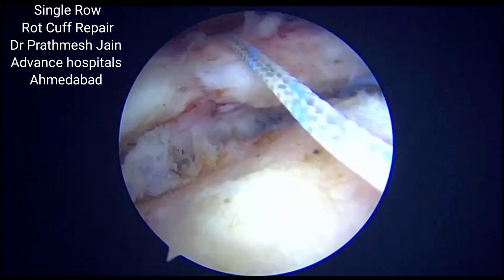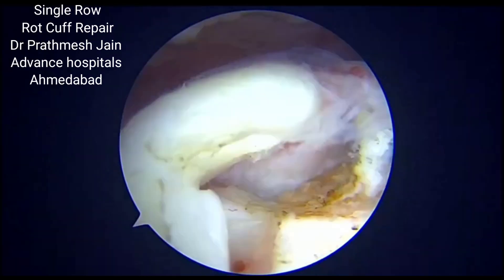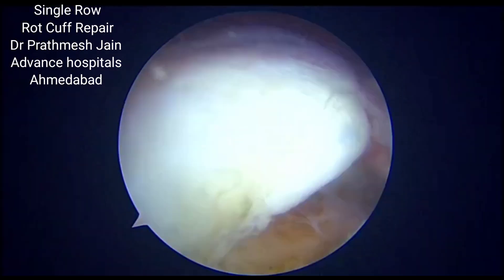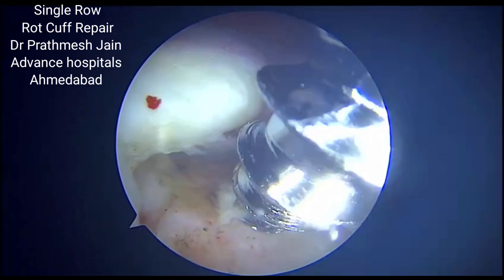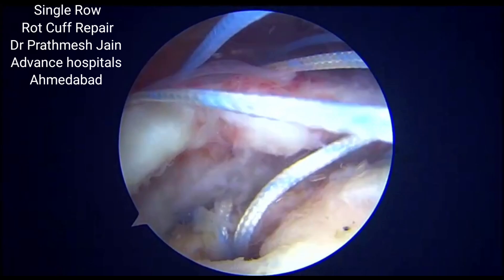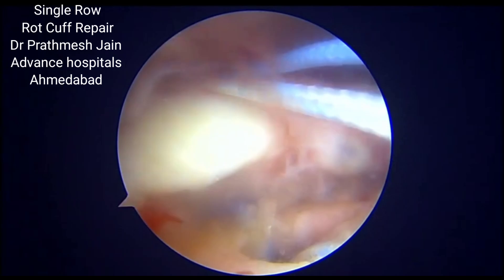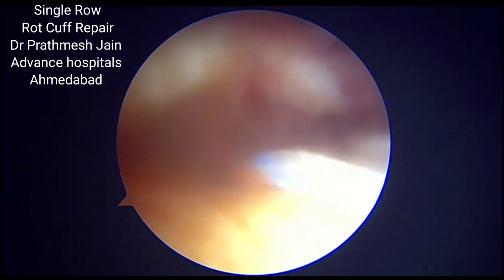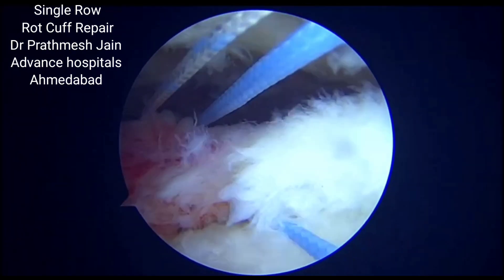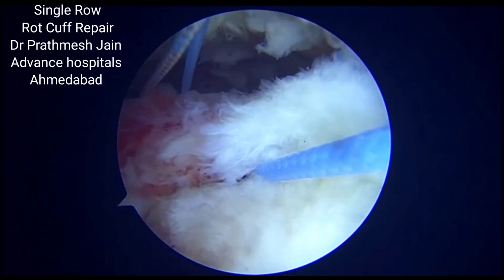Here we have passed the first anchor and then we have passed the three suture limbs through the cuff. Now we will be passing the posterior suture anchor. We recommend one anchor for approximately 1.5 square centimeters of exposed footprint. We need to put three suture limbs through the cuff after we put the anchor. Then we will be tying the simple suture first, which will reduce the rotator cuff onto the footprint. Thereafter you can tie the mattress suture limb.